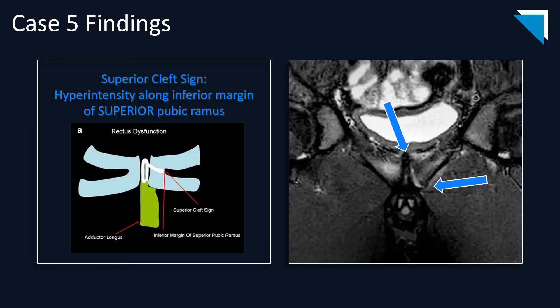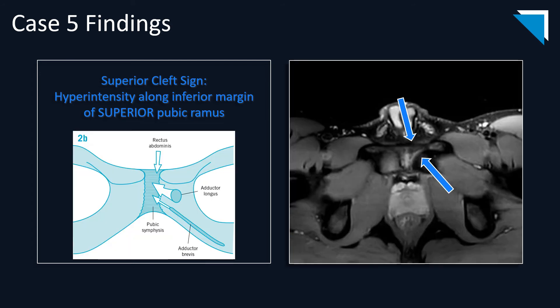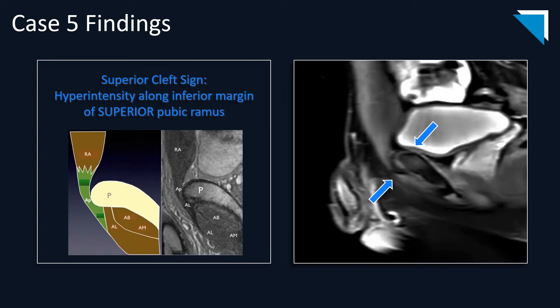Case five is a football player presenting with persistent, somewhat debilitating groin pain. On this small field-of-view coronal STIR image, you see a superior cleft sign, which is a hyperintense signal along the inferior margin of the superior pubic ramus. This is also demonstrated on an axial small field-of-view STIR image and confirmed on a sagittal image showing a hyperintense curvilinear signal along the inferior margin of the superior pubic ramus.